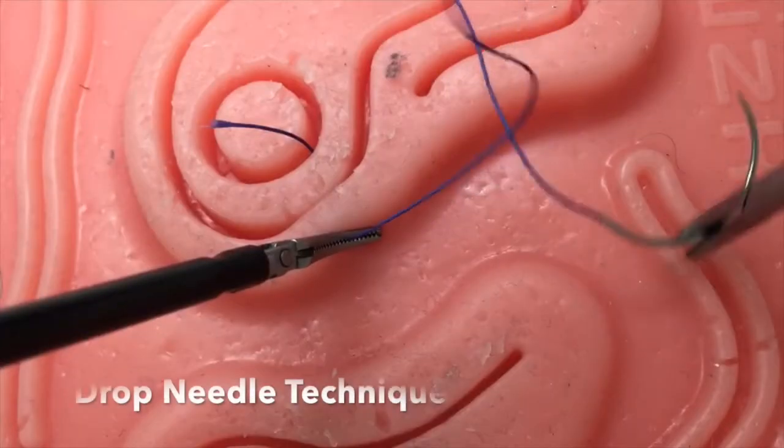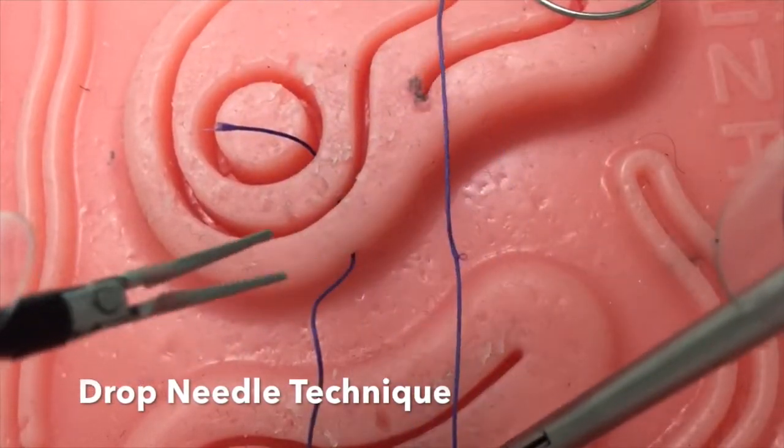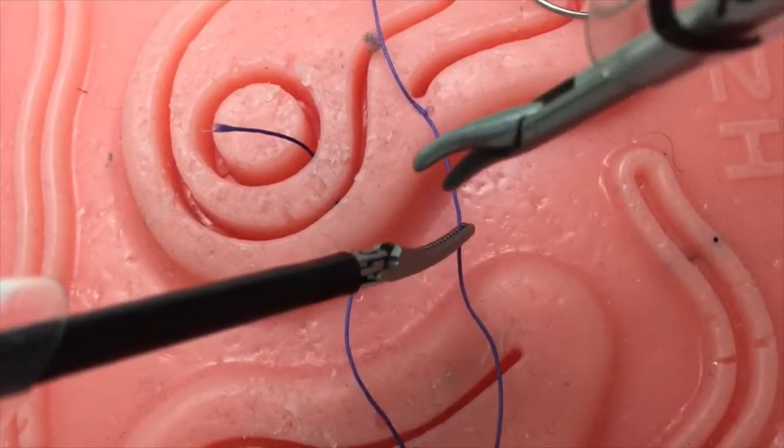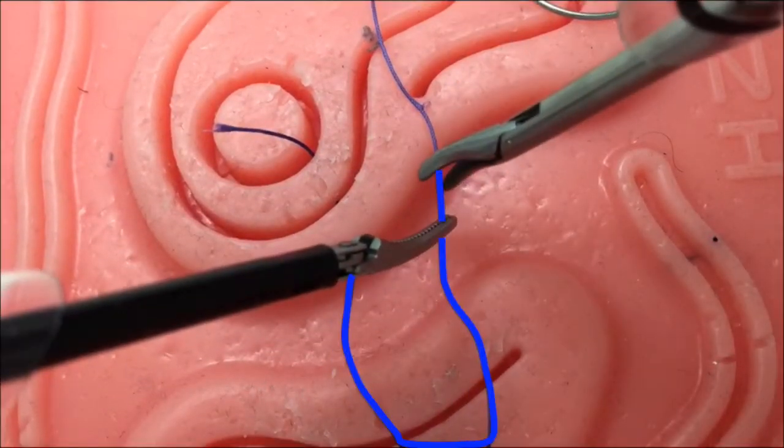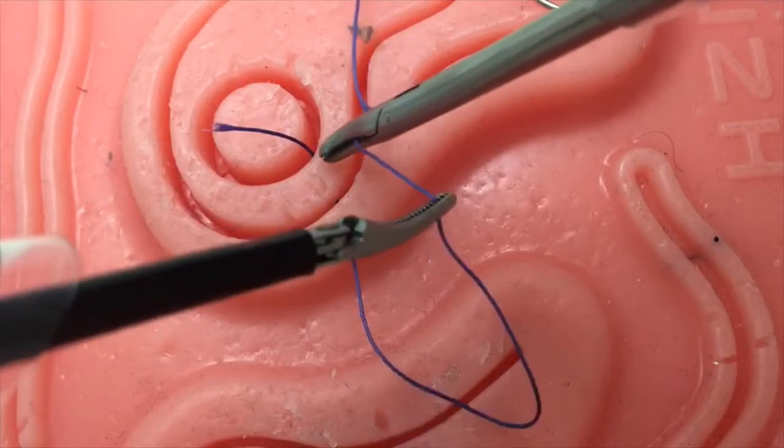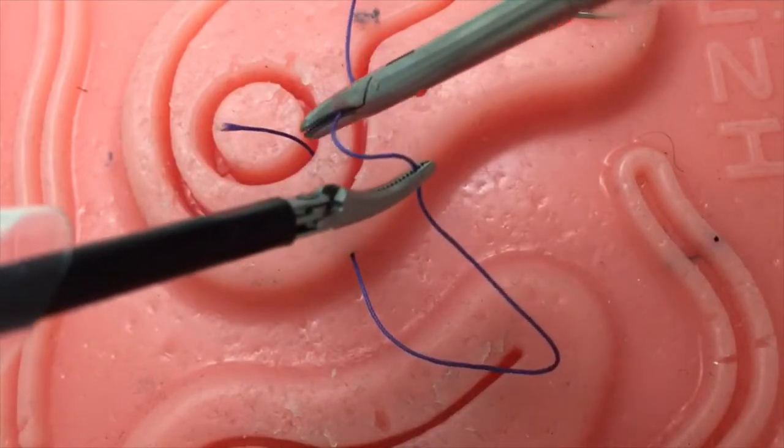Knot Tying. This video will demonstrate two intracorporeal suturing techniques. The first one is the drop needle technique. The setup is key. First, create a long elongated U with the suture. By creating this elongated U, we are decreasing our instrument to suture angle, a key feature to intracorporeal suturing.